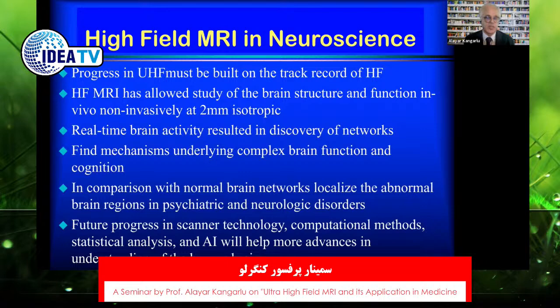It is possible. So, in MRI, we have different types of pulse sequences. Sometimes when we're imaging a structure for very high resolution, exquisite T1, T2 weighted image, we can spend 5 minutes to acquire a very high resolution image. Or sometimes we don't have the luxury, and we have to do fast imaging. And there are methods of acceleration of fMRI images. In my own research, we can acquire an image of the entire brain in less than 1 second.